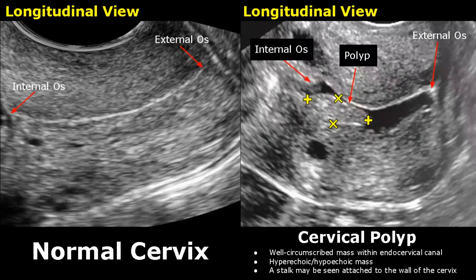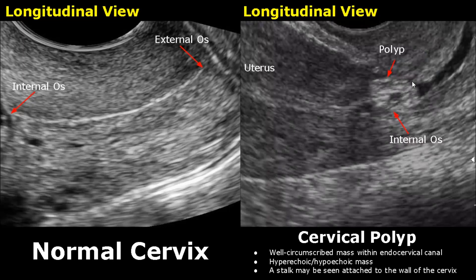Cervical polyp refers to a well-defined circumscribed mass within the endocervical canal. A polyp is attached to the wall of the cervix with a stalk, but this stalk is hard to see on ultrasound. This mass can appear either hyperechoic or hypoechoic, but mostly it is hyperechoic to the myometrium. This is another case of a cervical polyp — a well-circumscribed round hyperechoic mass in the cervix.